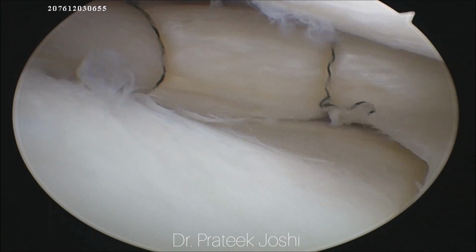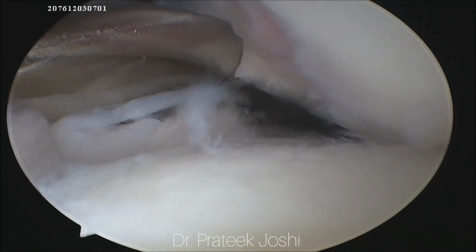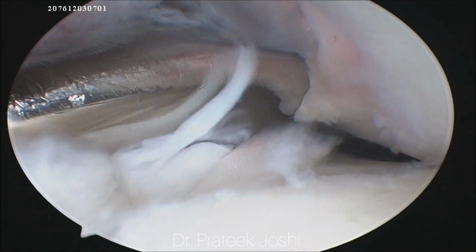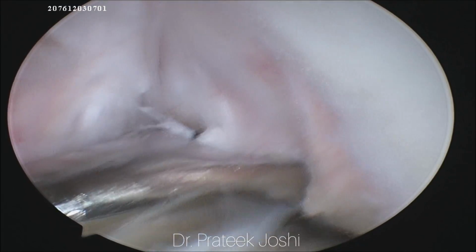So now we'll shift our focus to arthroscopic ACL reconstruction, for which I am going to introduce a 6 mm offset femoral aimer, and as you can see, it is sitting nicely on the ACL femoral footprint, through which I am going to drill the guide wire through the lateral femoral condyle.